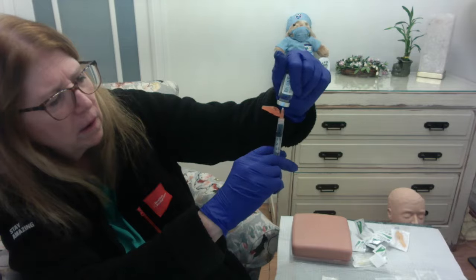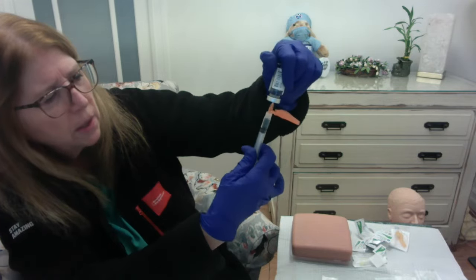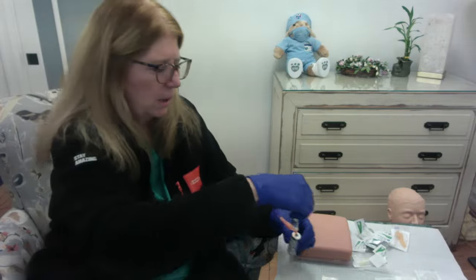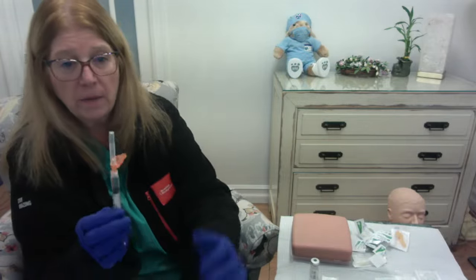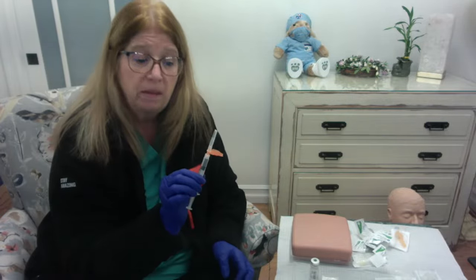Looks like I did. So I might be good here. Okay, I'm going to get to my 1 milliliter mark, kind of look around. I don't have any air bubbles. I'm going to invert again. I'm going to take this needle out. I am going to safely recap, one-handed, snap this on, and now I'm going to go to my patient's bedside.